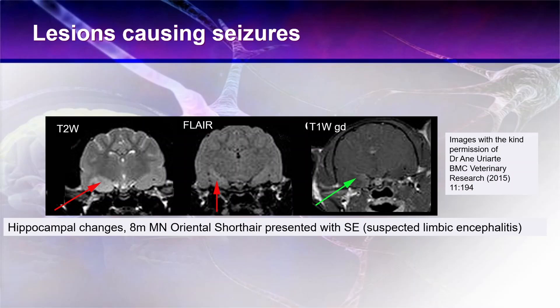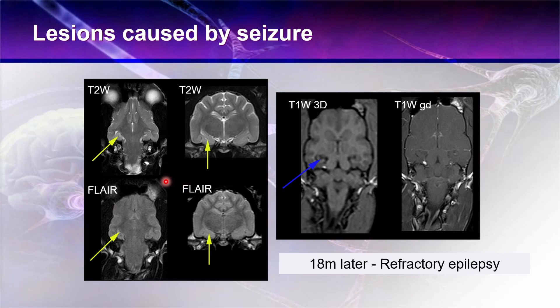I then inherited this cat after Anna had given it very appropriate treatment for limbic encephalitis, including steroids and anti-epilepsy drugs — which is the subject of a future lecture. We repeated the MRI scans 18 months later because the cat had refractory epilepsy. We can now see that there have been some permanent changes caused by the ongoing encephalitis and probably the seizures. There is now atrophy of the temporal lobe, and we can still see some changes on the FLAIR, but it's not quite as distinct.